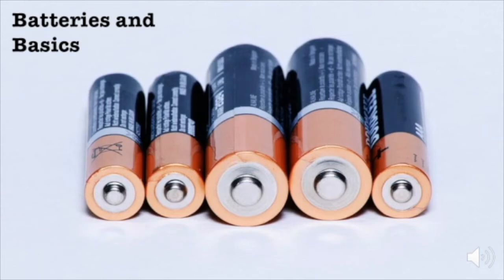Secondly, look at the controller. The LVAD controller displays error messages. It might be something simple that you can fix. For example, if the error message says battery, the replacement is simple. There's just a clip that locks the battery into each holder, and the patient typically stores many spare batteries in their house. Make sure you only replace one battery at a time.